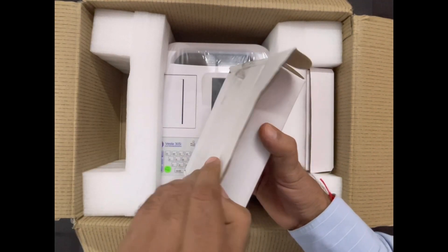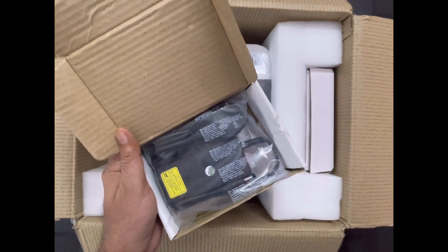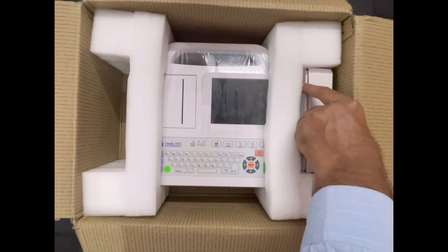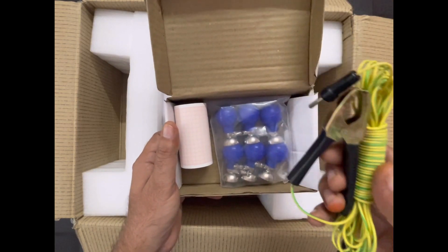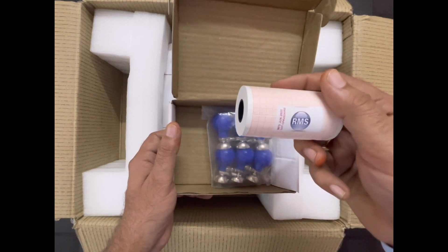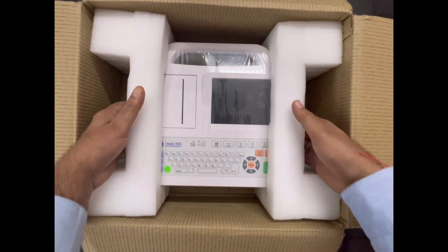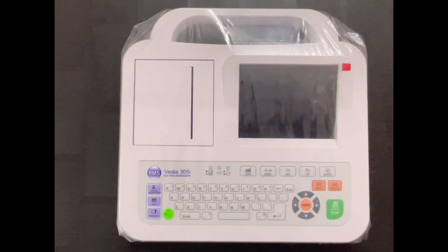In this small box, we will get 2 fuses and 1 ECG charger. In the other small box, we will get 1 ECG earthing wire, 1 ECG roll of 80 mm, and 1 set of bulb electrodes. And finally, this is the main console or main part of the ECG machine.